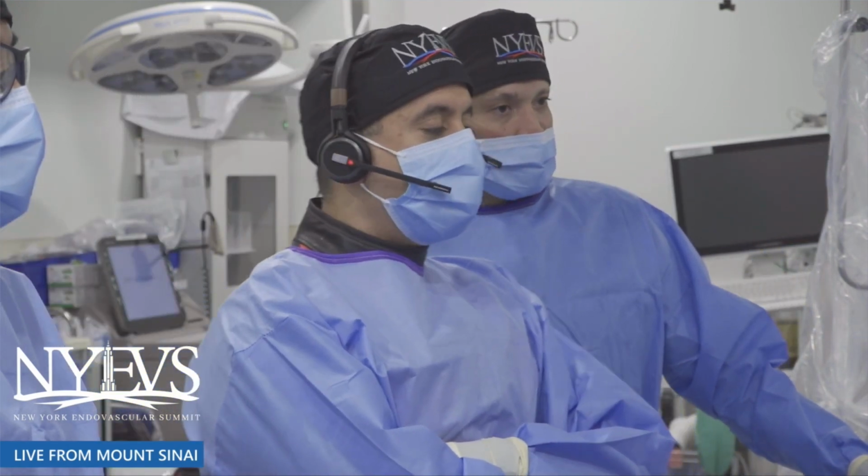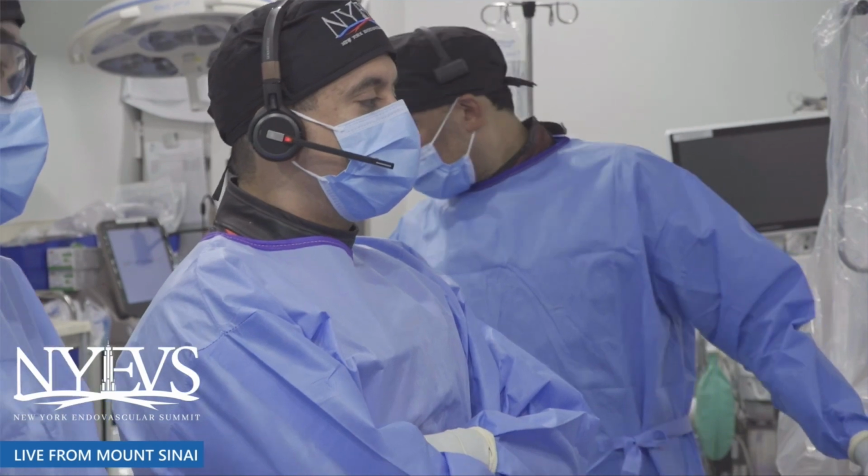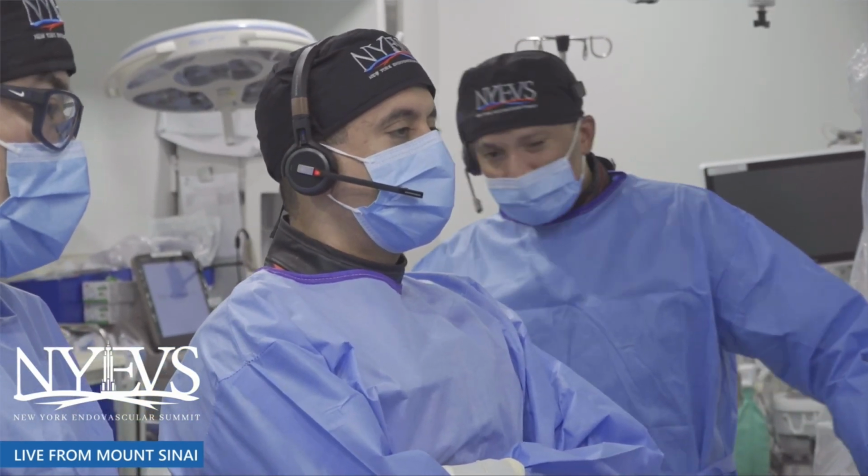I've got to say, I think I would go for a non-covered stent actually. Uncovered. Bare metal.